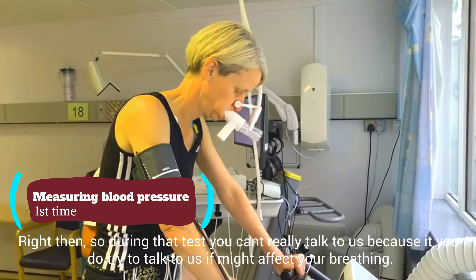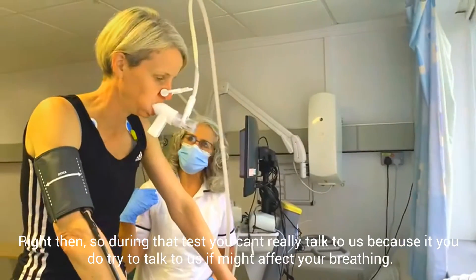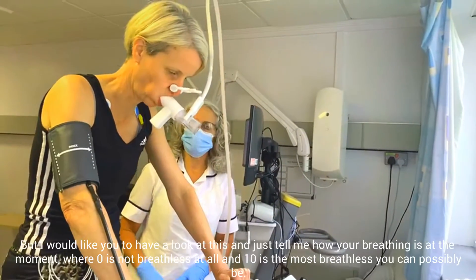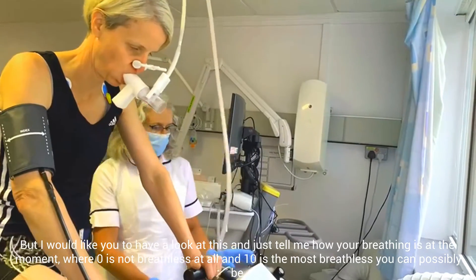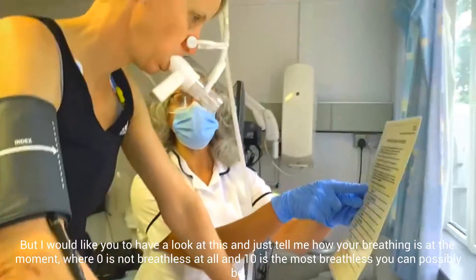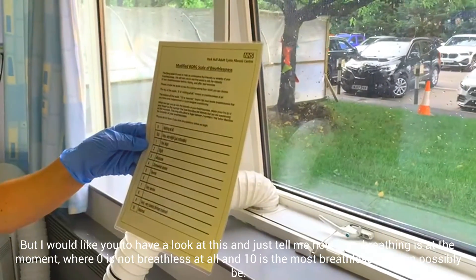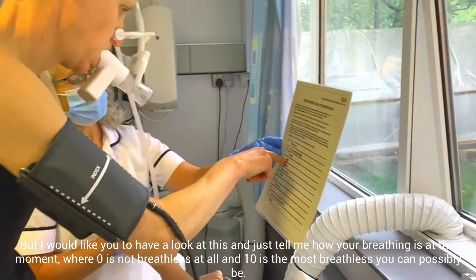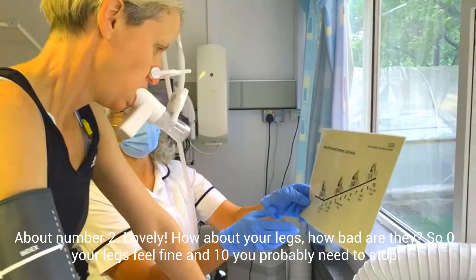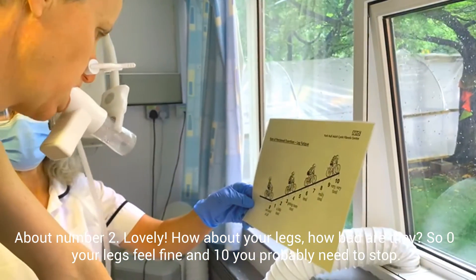So during the test you can't really talk to us, because if you try and talk sometimes it affects your breathing. But I want you to have a look at this scale and tell me how you think your breathing is at the moment — where nought is not breathless at all and 10 is the most breathless you could possibly be. And about number 3 for your legs — how bad are they? Nought is your legs feeling fine and 10 means you probably need to stop.